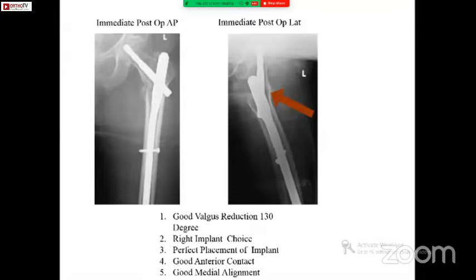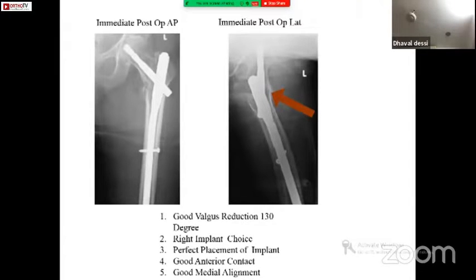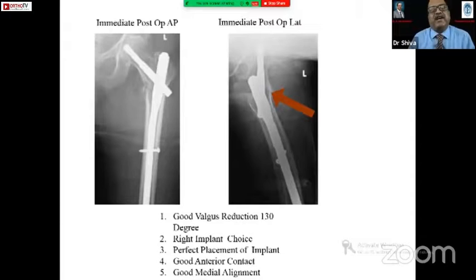Now you show us that, Navin. Though it is a zero reduction, if the valgus is normal, see, there is a medial void. Whenever there is medial void, additional 5-degree valgus is always required, which is not there in this case. It is going to have a varus cutout in this case.